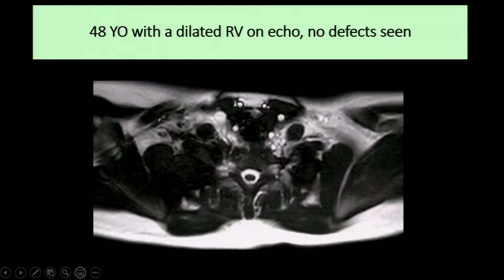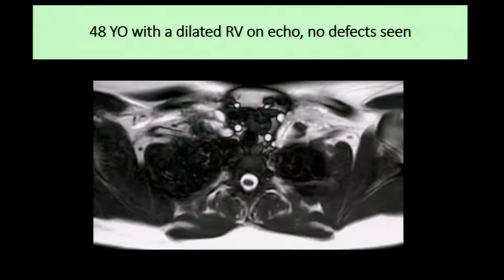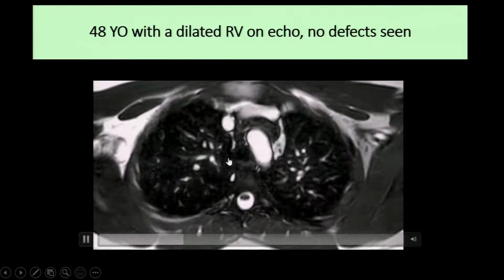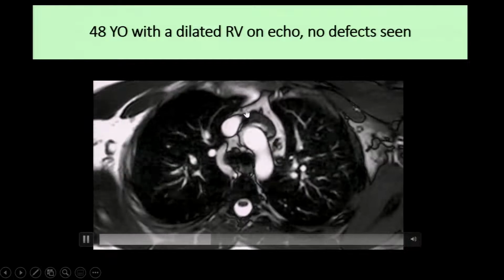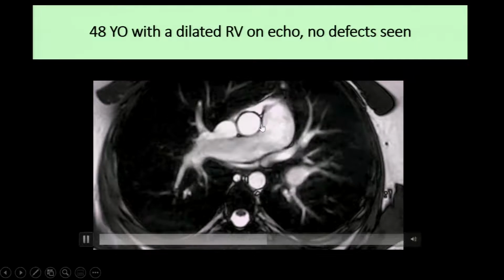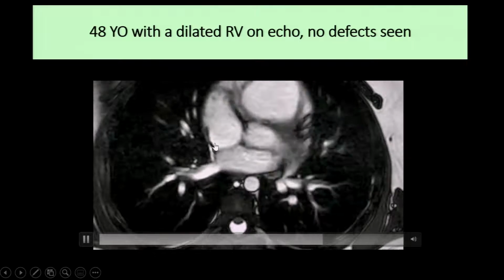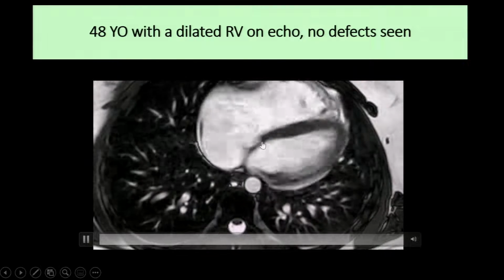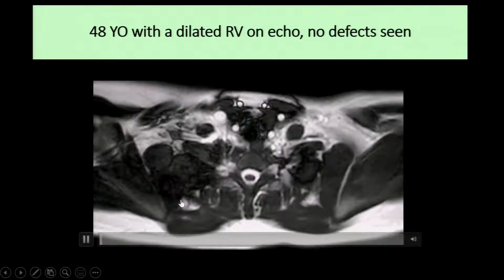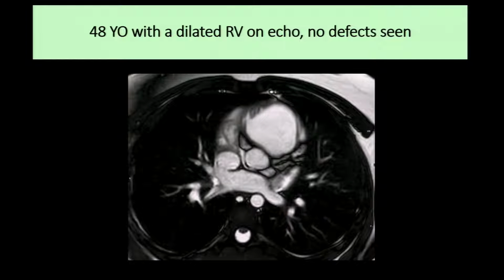So I'll play it again for everybody to get a chance to look at this. This is the way I like to screen for this, looking at my axial stacks, identifying the innominate, identifying the superior vena cava, and you can see the defect right there. And you see that if you didn't image all the way up, you would have missed it. The atrial septum per se looks intact. And so this is a sinus venosus defect, right?